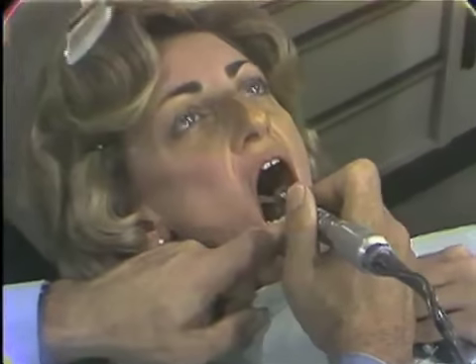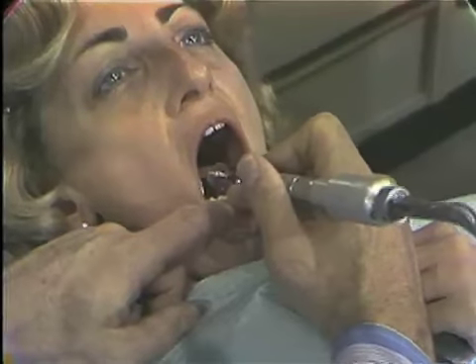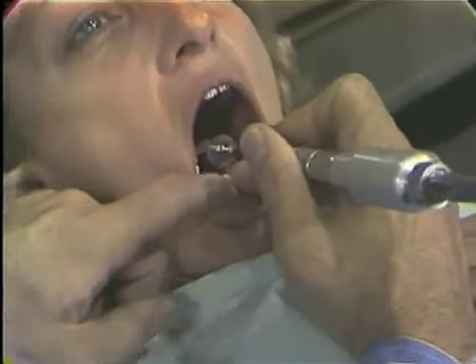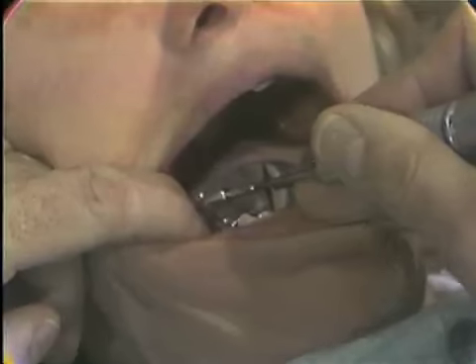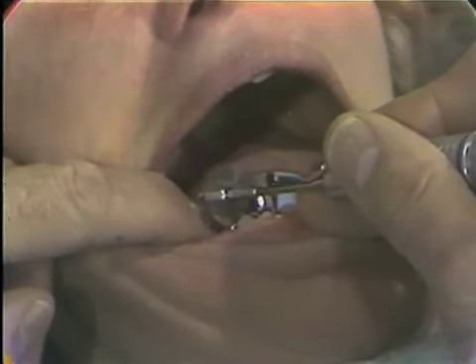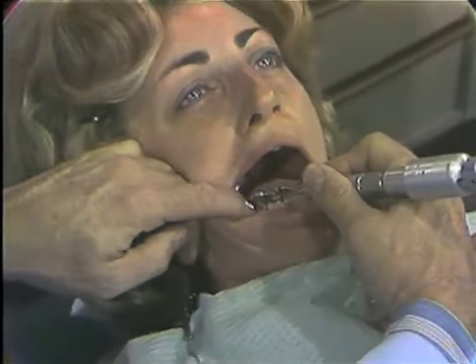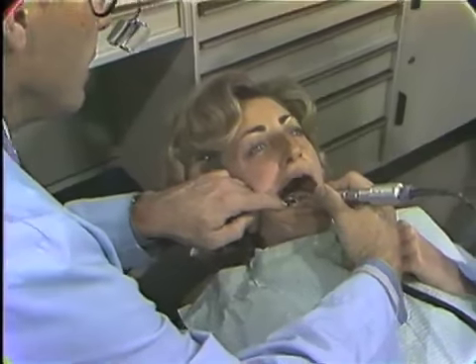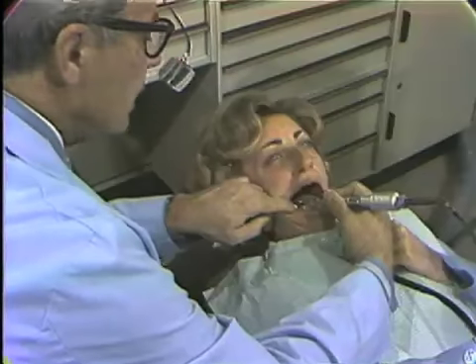This is true if you're doing slicing or any type of preparation. Try not to pinch a patient's lip. And put a firm finger rest on the cuspid or the laterals on the opposite side of the arch. And then you will come down and you will see that I am looking between the tooth and the disc. If we could widen that shot just a little bit to show the hand position and my head. I am now looking, come back a little further, between the tooth and the disc, as you can see now.